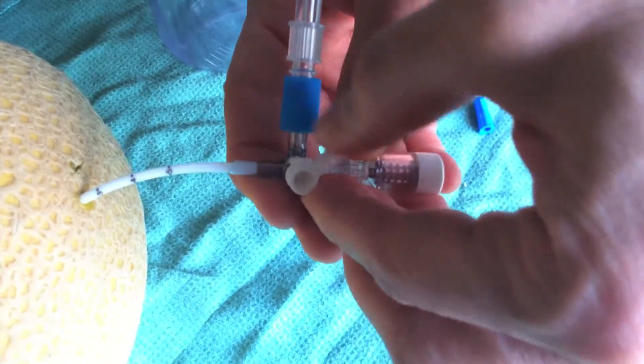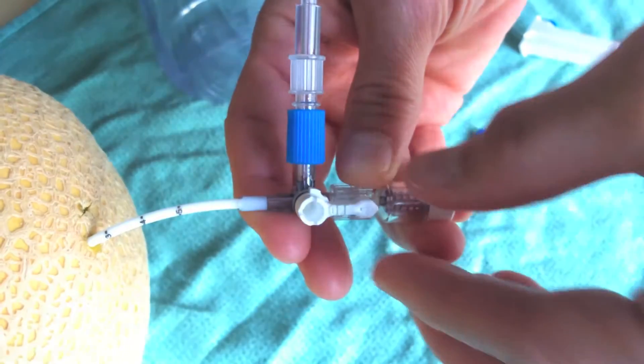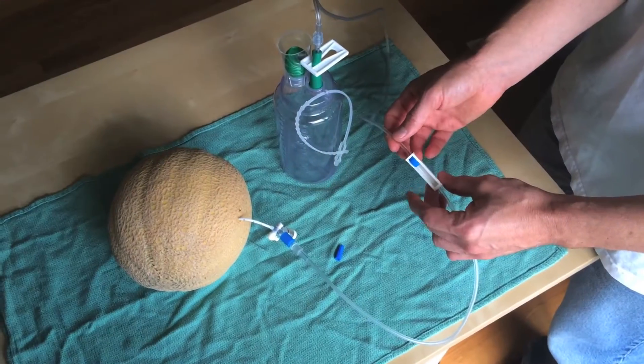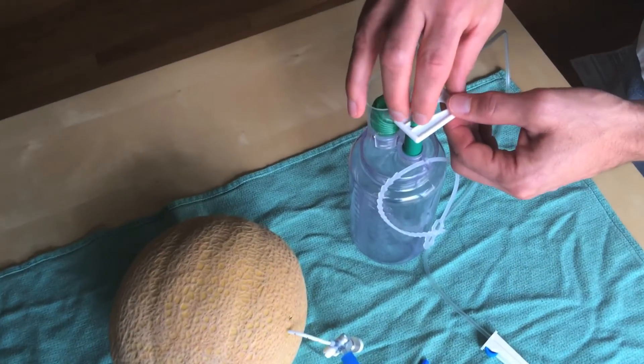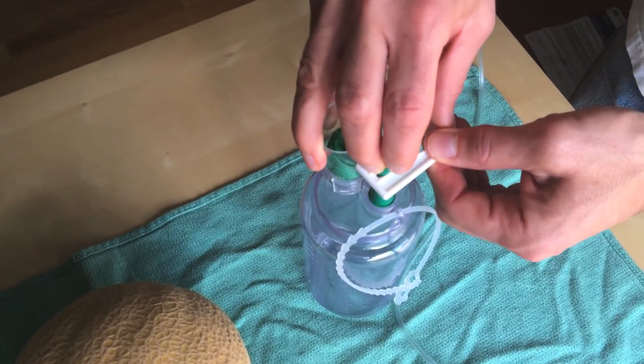Next, switch the stopcock to the open position. Ensure that the clamp on the tubing is open and you can start the drainage by releasing the white clip on the vacuum bottle.